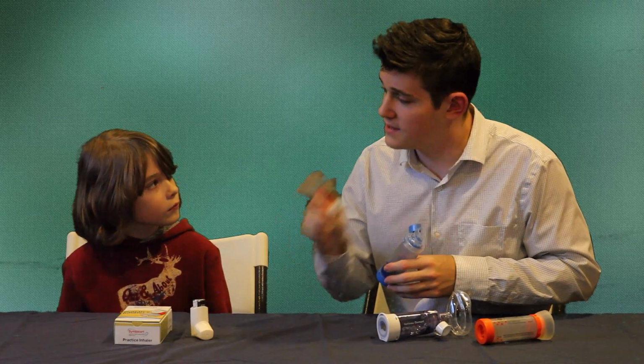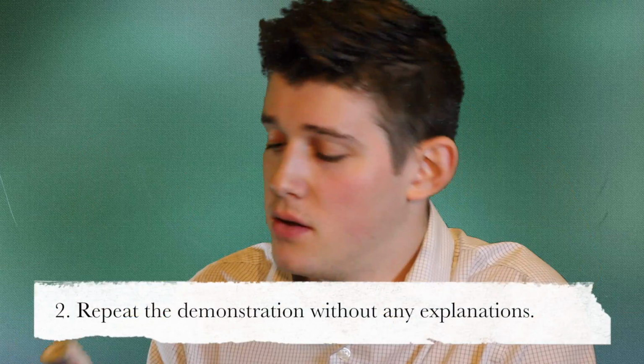Shake the inhaler for 5 seconds. Connect the inhaler to the back of the spacer. The cap's off. You breathe all the way out. Put the tip of the spacer in your mouth. Put your teeth on it, then your lips. And then while your breath is still out, you press down the inhaler as you start to breathe in.